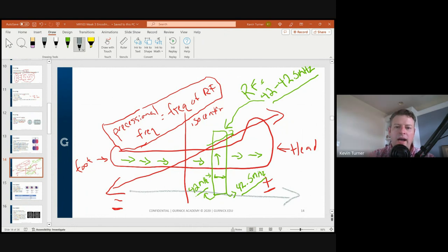So in an MRI, what a slice is, we turn on one of our physical gradients and then we put in RF energy in a range that matches the area we want to be the slice. That is called a bandwidth, because a bandwidth is a bunch of different frequencies. That's what we call a bandwidth in MRI. So that's how we create a slice.